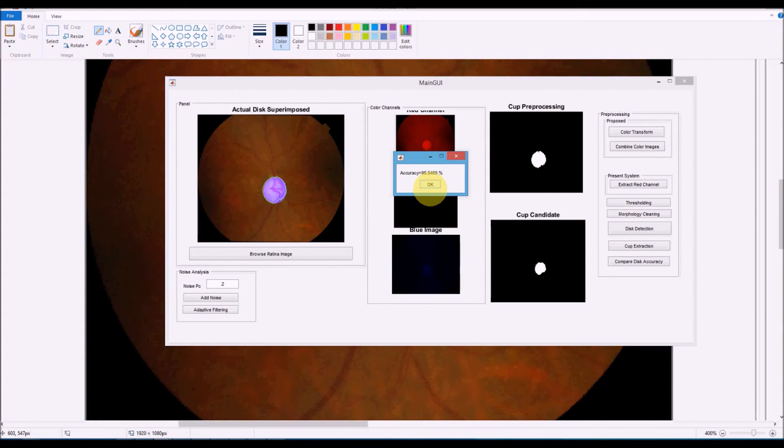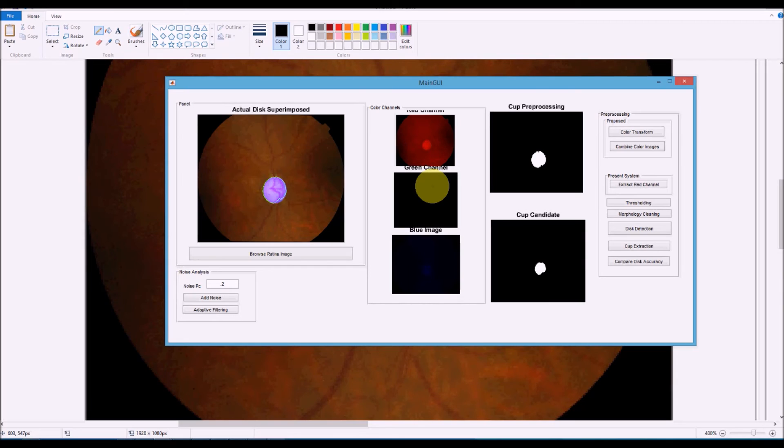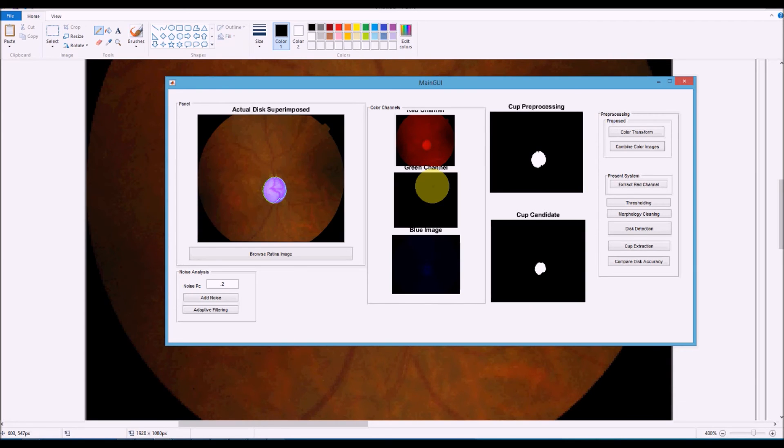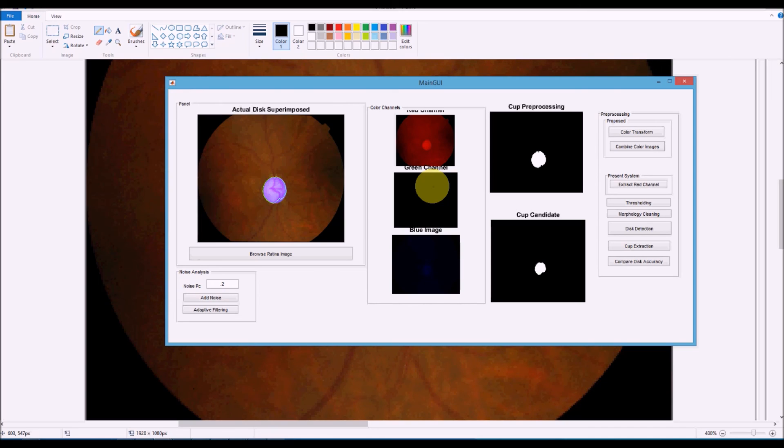If we go for multiple color channels and detect based on multiple color channels, we get much better accuracy for disk detection. Once disk detection is more accurate, cup detection automatically becomes more accurate. Therefore, we can conclude that our proposed system performs much better than the present system, which is red channel-based extraction of the disk and green channel-based extraction of the cup area.